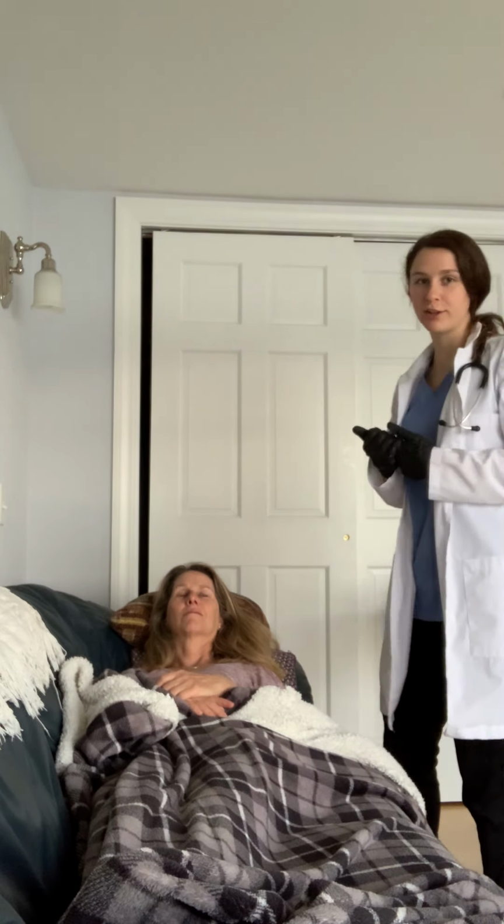Now, according to where you work would indicate whether you return the gastric contents back to the patient or discard of them. And depending on how much, if there's too much, you may want to hold the feeding, but hers was not too much. And it seems to me that she's tolerating the feedings well, because you didn't report any nausea, vomiting, diarrhea. I didn't see any abdominal distension, and there's no pain.